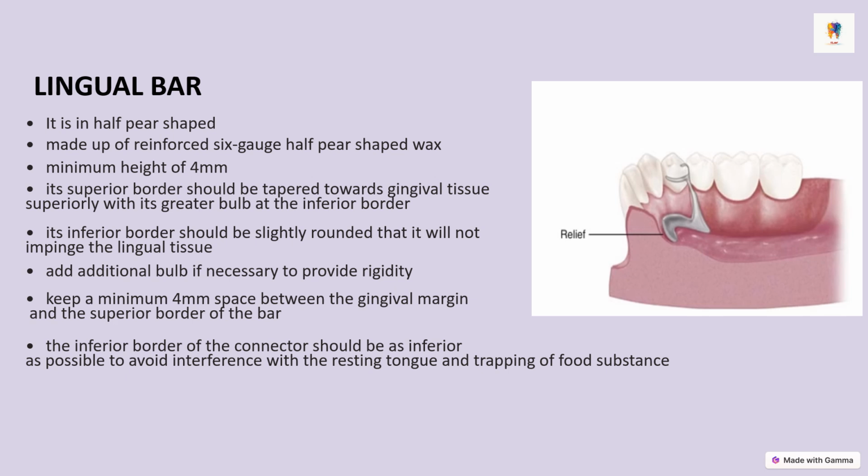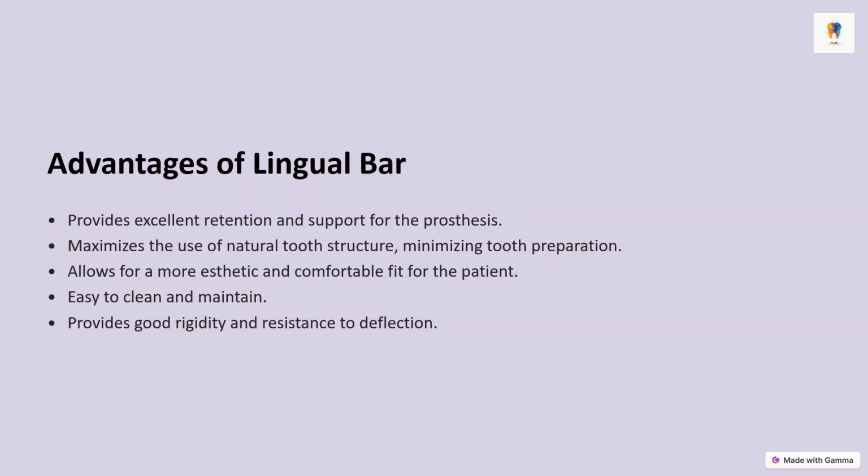So moving on. Now the advantages of a lingual bar are that it provides excellent retention and support for the prosthesis, maximizes the use of natural tooth structure, and minimizes tooth preparation. It allows for a more aesthetic and comfortable fit for the patient, is easy to clean and maintain, and provides good rigidity and resistance to deflection. So these are the advantages of your lingual bar.